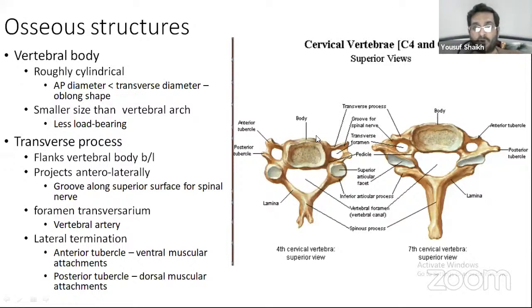It should not go lateral. Even if your screw is going a bit lateral, then it is unlikely it will enter the neural foramen unless the plate is very skewed to the lateral. But if you put a plate in the midline, then it is unlikely to enter the neural foramen.